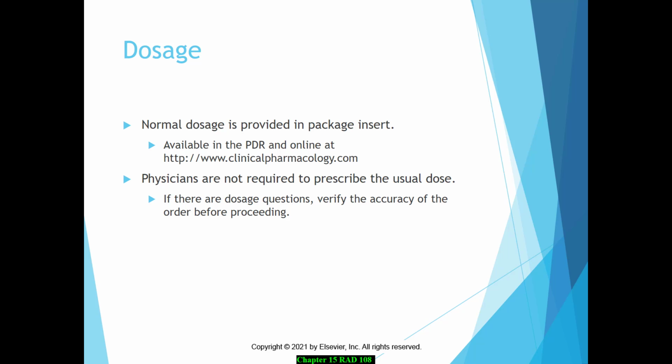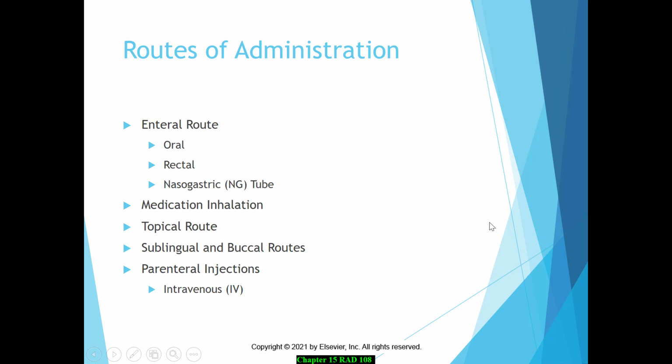So most of our procedures come pre-packed. We take the package out and everything we need is in that kit. That makes it easy because then we know that it's going to have the right amount and the right dosage for the particular patient that we're doing. So typically, we hold the vial up so that the physician can verify what's in the kit before they draw it, and then they administer that to the patient.